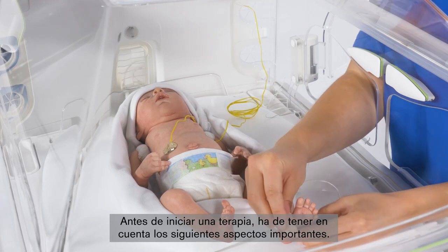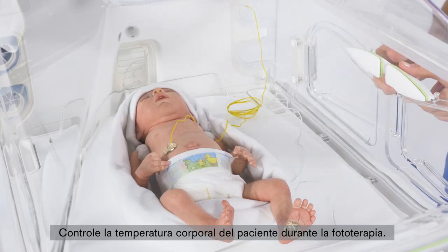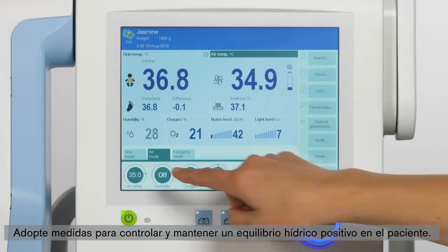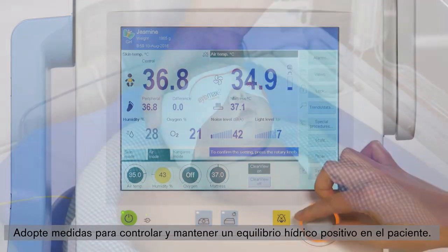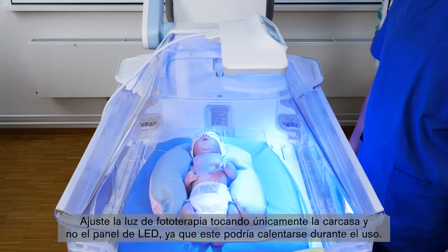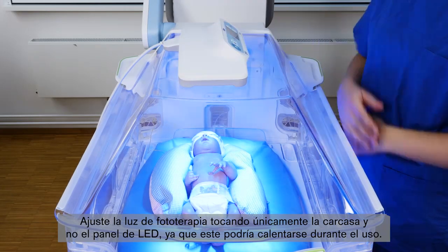Before you start a therapy, you have to consider the following important aspects: monitor the patient's body temperature during phototherapy, measure patient bilirubin levels regularly, take steps to monitor and maintain positive water balance in the patient, and always use eyeshields to protect the patient from phototherapy equipment radiation. Adjust the phototherapy light only by touching the housing and do not touch the LED panel, since it may become warm during use.